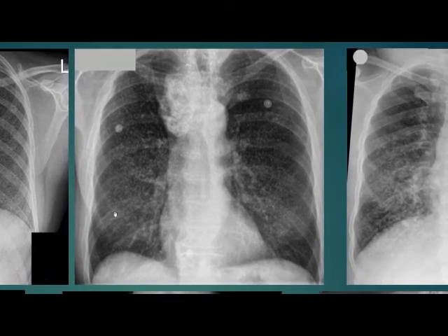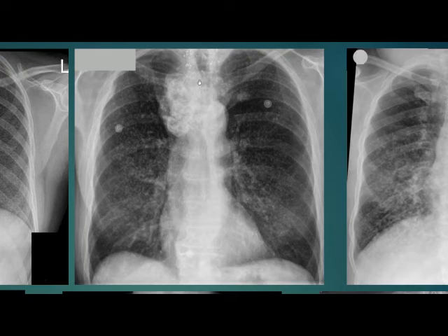In the second case, again there are miliary nodules. We can see an obvious calcified mass in the upper mediastinum and clips in the lower part of the neck. This is a case of thyroid recurrence with miliary metastasis.